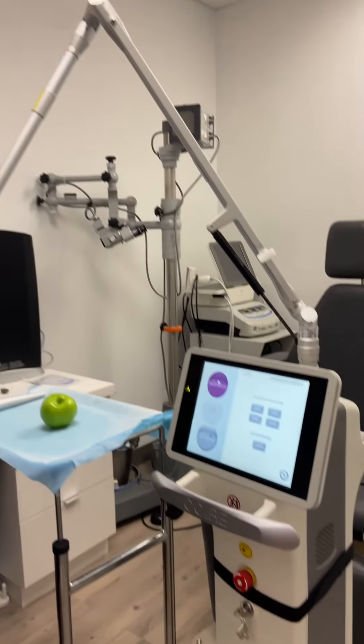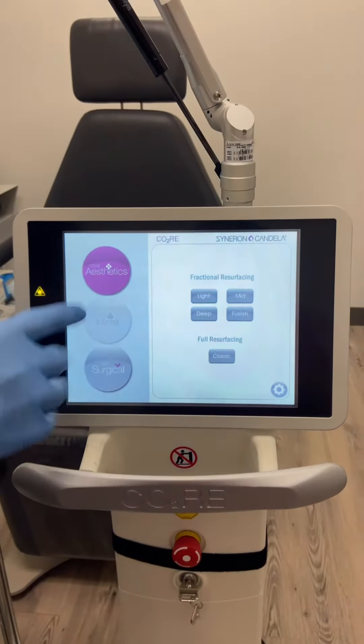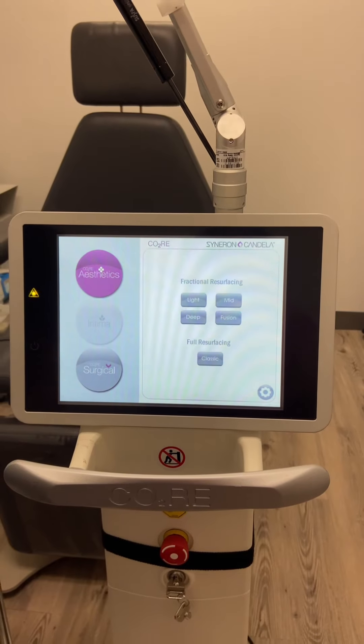I'm going to do a demonstration today on what I use CO2 laser for, how it works, and what you can expect. So this is the laser here, this is the Core from Candela. As you can see, there's surgical mode and aesthetic mode. There is an intima mode, but we don't do that here in the office.